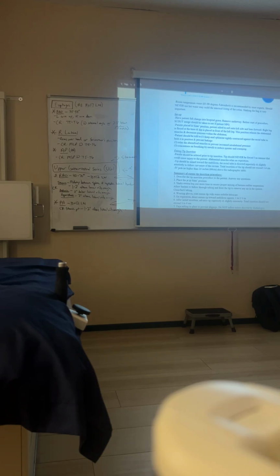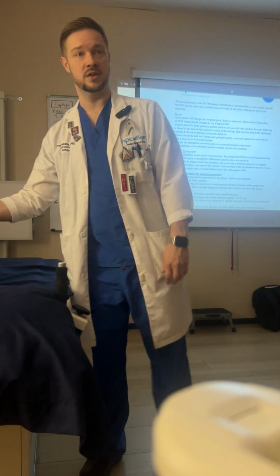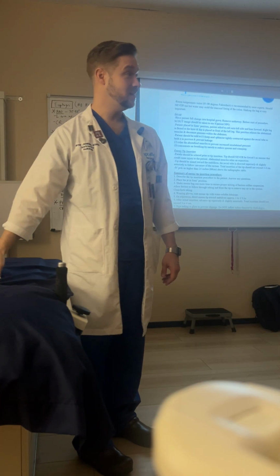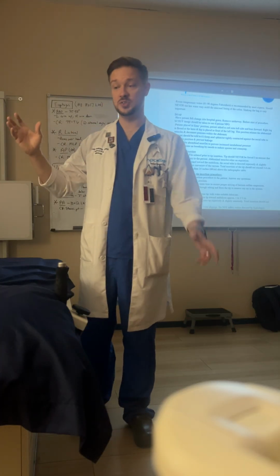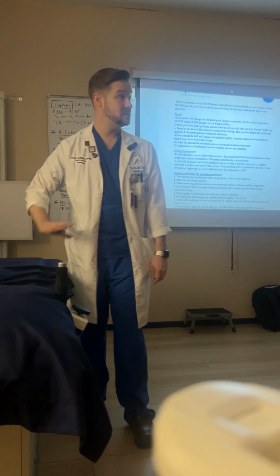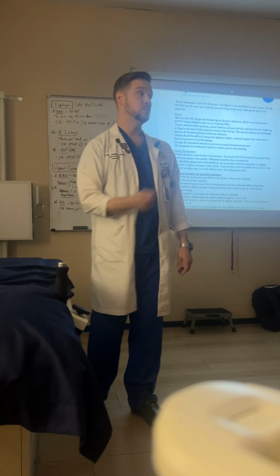Say the tip pops out halfway through the exam. What's the procedure after that? Everything stops because you probably got a huge pool of barium on your table. And anywhere where there is barium on the sheets, on the patient, on their gown, is going to show up as a radiopaque object, right? So now we have to strip the patient down, give them a wet towel to clean up. We have to clean everything off the table, reset, and start over.